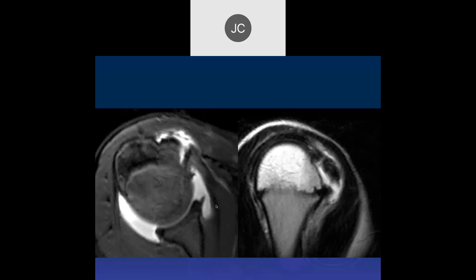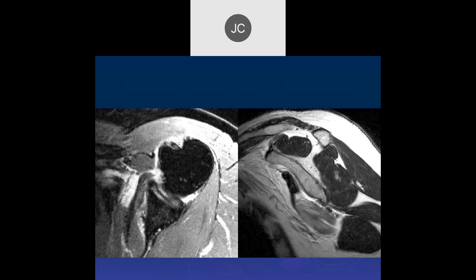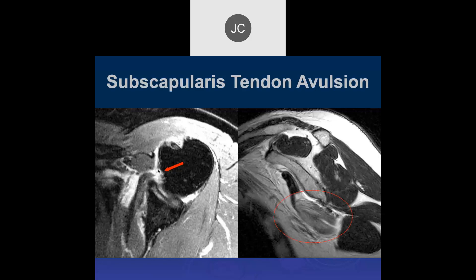Looking at the subscapularis, there's almost another avulsion — but this is a kid, so that's bone, and it's an avulsion. There's the CT. On axial and sagittal views, it looks like a complete tear of the subscapularis with retraction, with the musculotendinous junction retracted as well — going along with the complete tear. There's muscle atrophy of the subscapularis. So this is more probably a chronic complete tear.